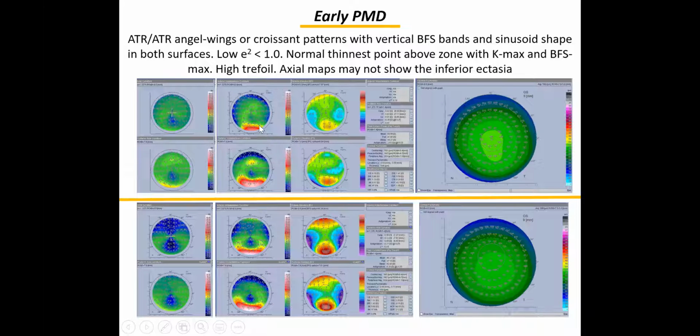If you try to see a cornea against the rule, never stop at the axial map. You must go to the tangential map. With the tangential map it is possible to see the periphery. So you are going to see the bump at the bottom. And the bridge in the Galilei elevation map is vertical, not horizontal anymore. And the lump is here at the bottom.